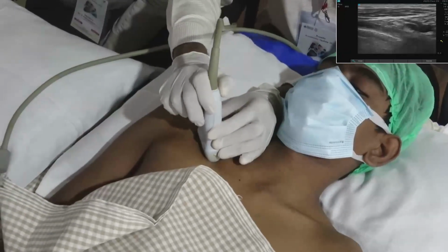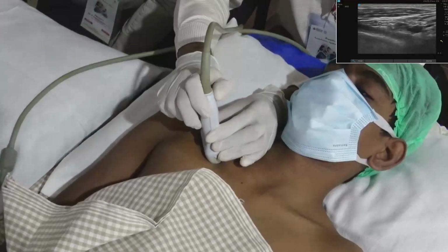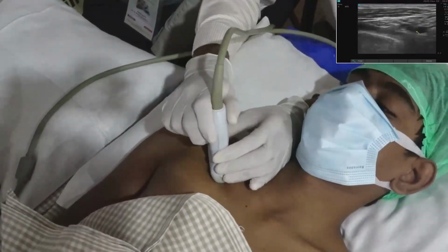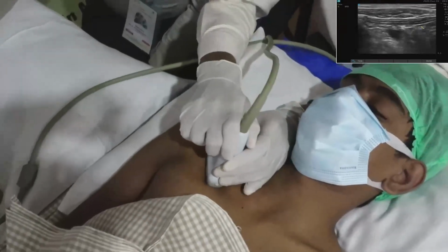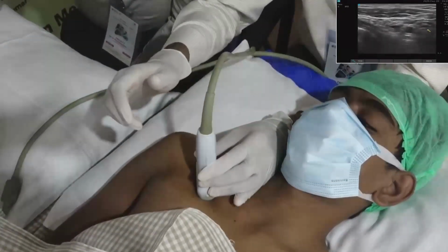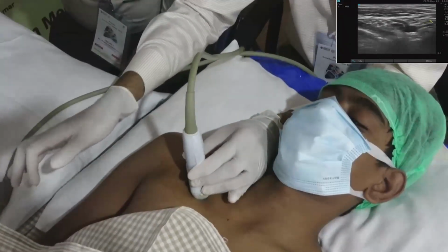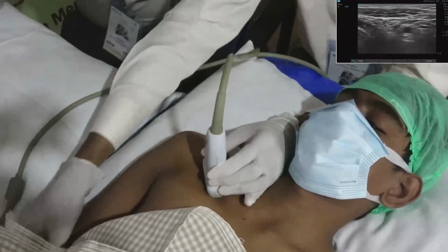The pulsating structure is the axillary artery, first portion. Then the axillary vein you can see. Now I'll move to the lateral side and try to see the brachial plexus elements, but it is difficult.